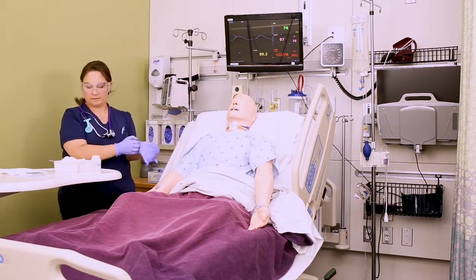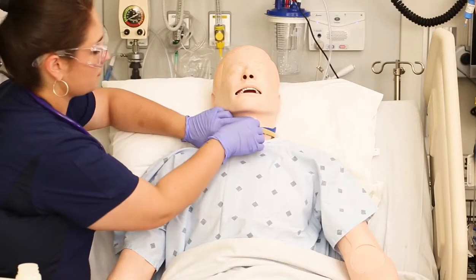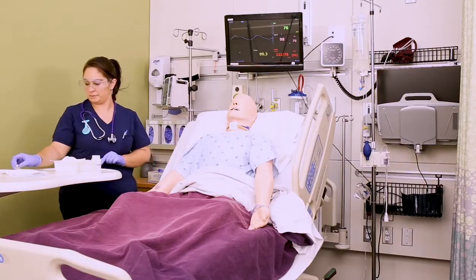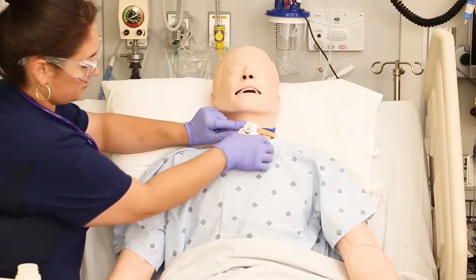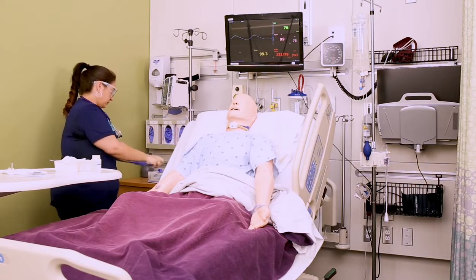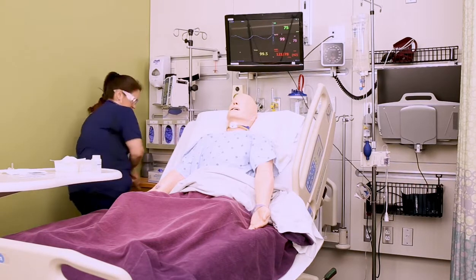And the first thing that you want to do for trach care is remove the inner cannula. Now, most of the time these are disposable, so this one will just get tossed. If you don't have disposable, you will have to clean it. You also want to remove the old dressing and then remove your gloves and perform hand hygiene.